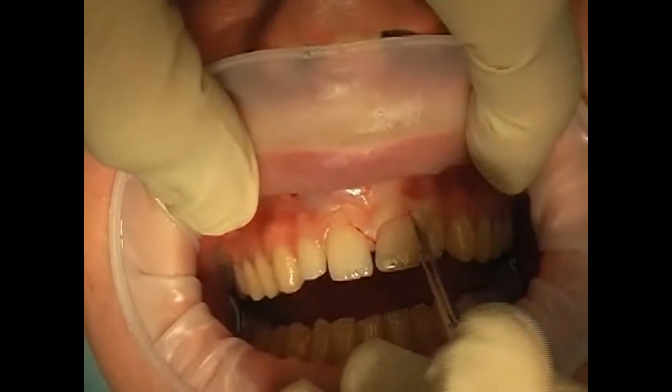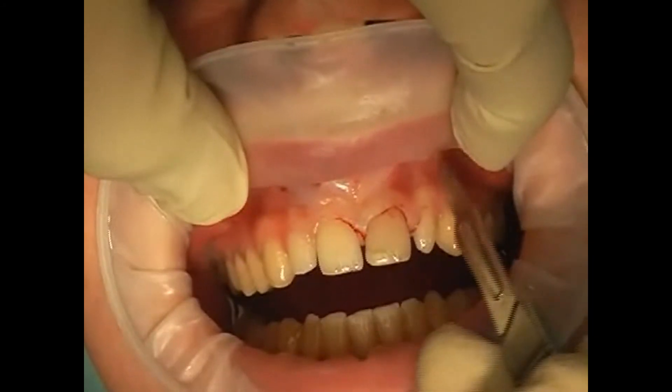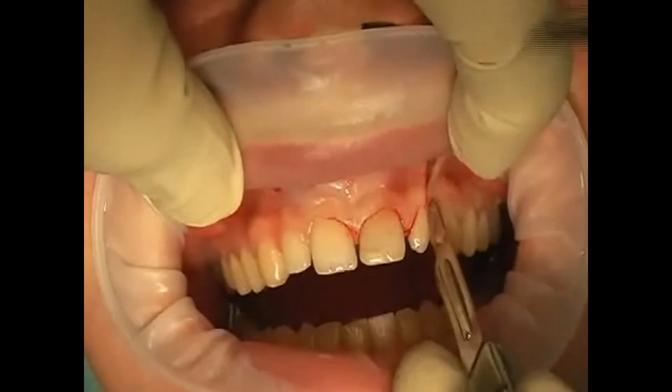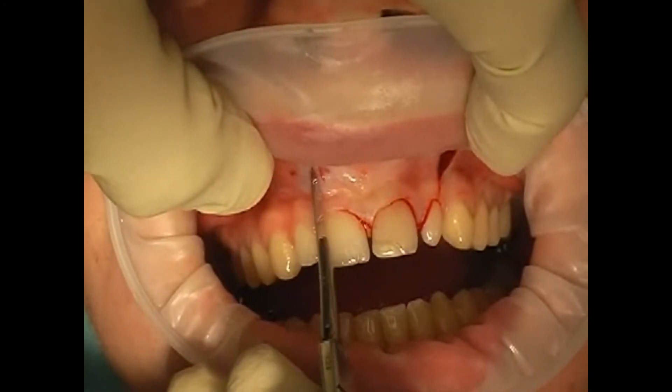This incision preserves most of the blood vessels, allowing the wound to heal faster and preventing scar formation. One potential drawback is that the gingiva may recede a bit after a gingival margin cut, but this usually only happens when the gingival flap is treated very roughly.